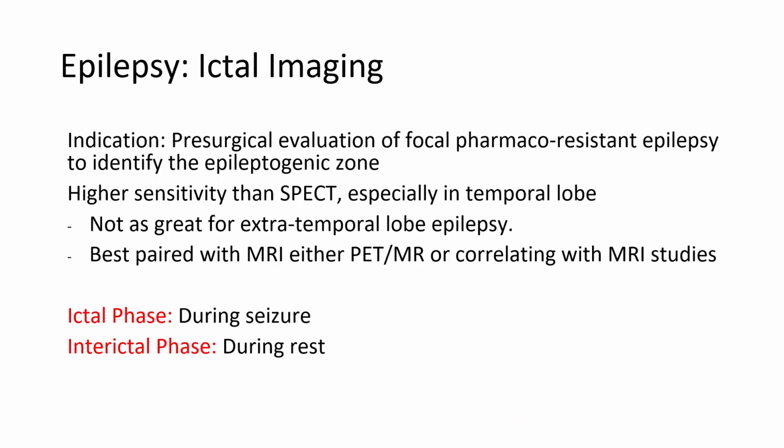Ictal imaging or epileptic imaging is often done as a pre-surgical evaluation, and this looks at pharmacoresistant epilepsy, so it's people who drugs aren't working for them, they're still having seizures, and it's done to identify the area of the brain that the seizure is coming from so that doctors can operate on that specific area of the brain.